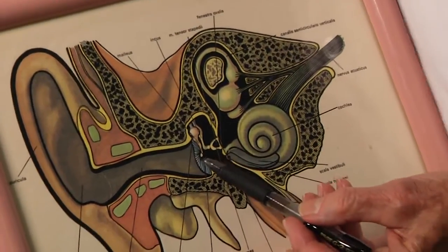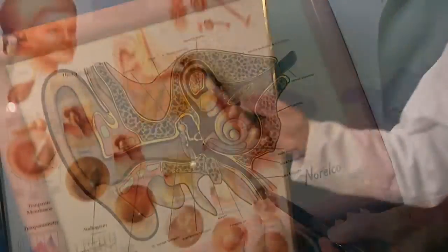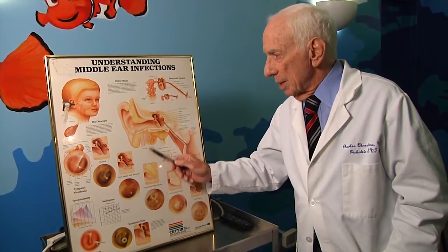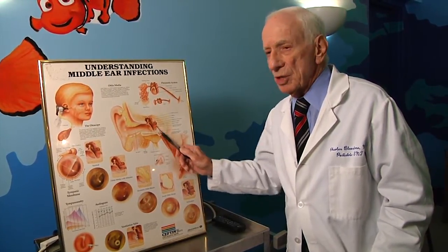We're trying to see how easy it is to open the eustachian tube — we want her to swallow, not to swat. Everybody's had popping and snapping when you go up and down in airplanes or go in a car. That's the eustachian tube functioning to get air into your middle ear. The beauty of the pressure chamber is that we can test function in a normal ear or one with fluid, but mainly a normal ear that has problems equalizing pressure.